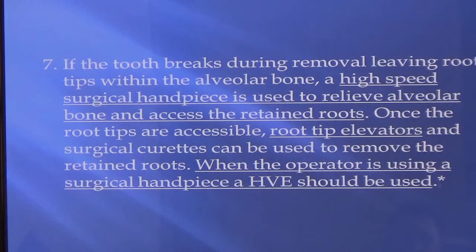Because the other one, with all the water, you won't be able to keep up and drown the patient, okay? So you've got to be able to switch just when you're using the high speed or the surgical tip or the high speed with water.